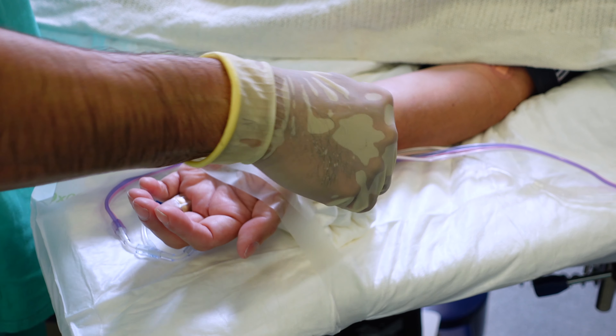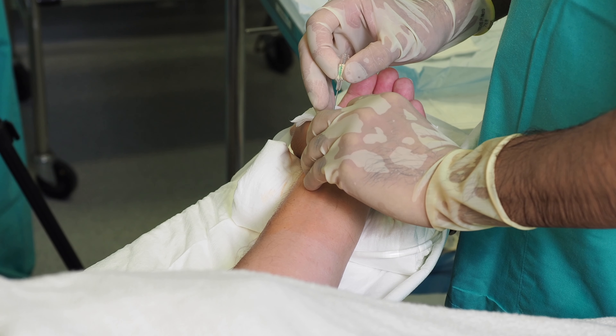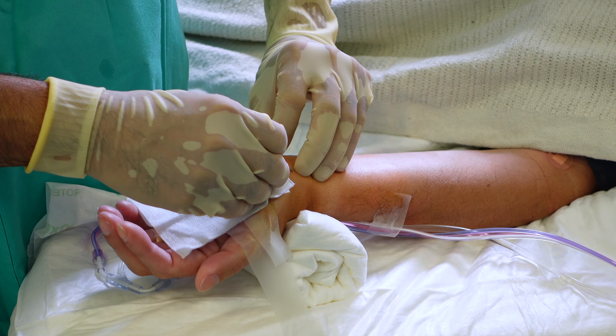Position your patient with their wrist extended. You can sometimes use a rolled-up flat pad or a bag of fluids to get the patient's arm in the right position. Clean the area with your chlorhexidine prep stick and then cover it with a sterile drape. Palpate the artery and introduce your needle at an angle that's not too steep so that you can get good flow through the artery without transecting it entirely. Remember, it's not a large vessel.